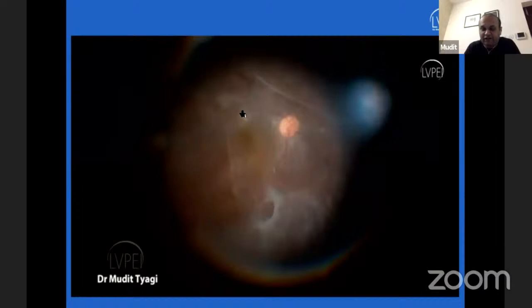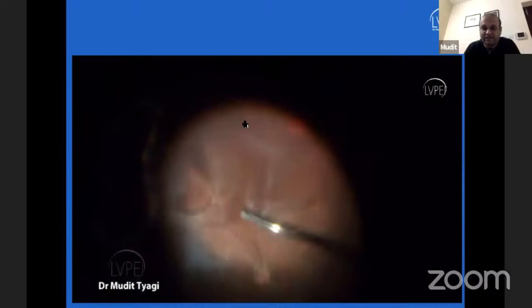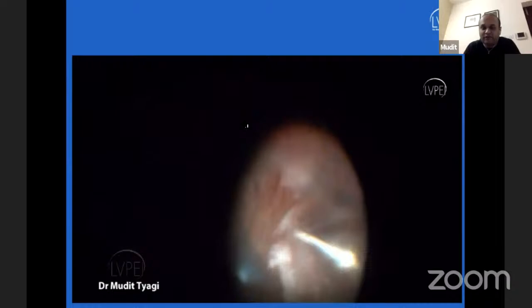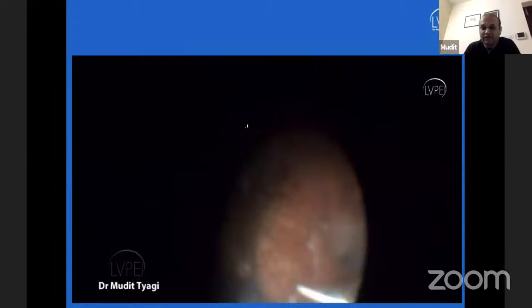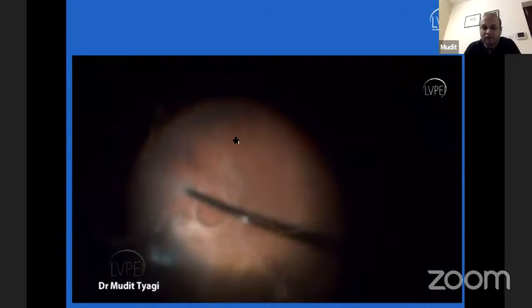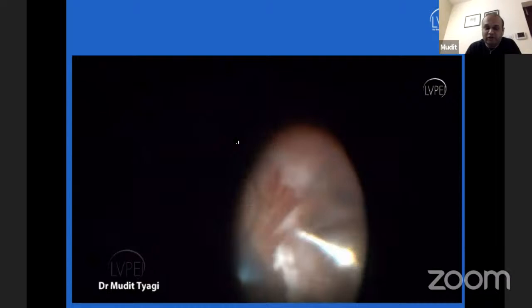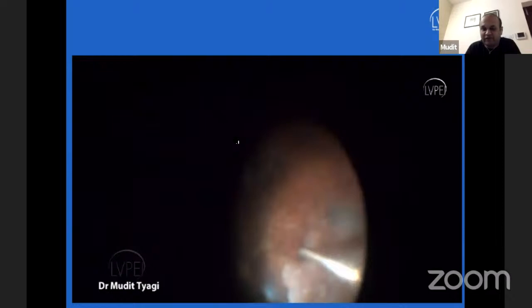The third point is that, again, if you look at this, this vitreous is extremely thick. And sometimes you need to not pull it, because if you pull, you will end up creating more iatrogenic breaks. The ideal way is to shave them as much as you possibly and safely can. So you can go ahead with the help of a 25 gauge cutter. You can easily go underneath them and just truncate this vitreous, cut it as close as you can to relieve the traction. The idea is to get rid of this tendency to pull at them, because if you pull upon them, they are so thickly adherent, you will end up creating more breaks in the periphery. So you have to be careful while shaving these peripheral vitreous bands. That is a way it is different from other detachments.